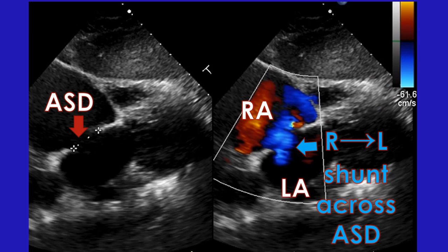Estimated right ventricular systolic pressure is mentioned as RVSP, calculated from the velocity of the tricuspid regurgitation jet by Doppler echocardiography. Indirect evidence regarding pulmonary hypertension will be obtained by the size of the pulmonary artery, movement pattern of pulmonary valve, and hypertrophy or dilatation of the right-sided cardiac chambers. In such cases, the shunt may be right to left or bidirectional instead of the usual left to right.